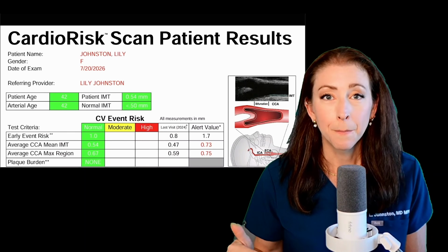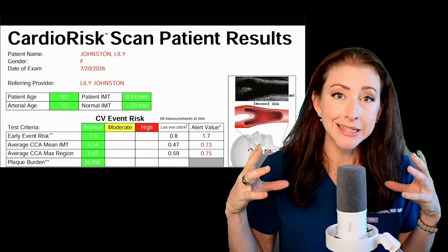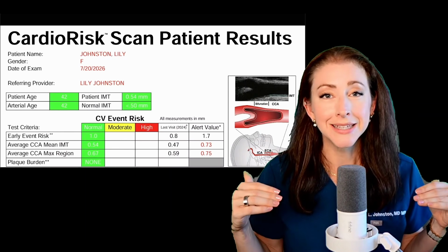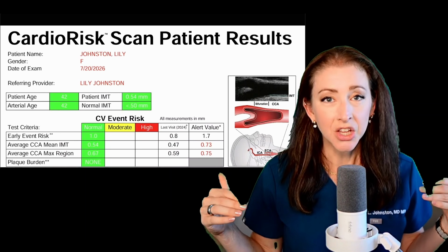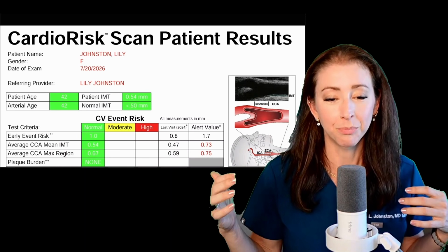There aren't big areas that are super thickened and then it gets thin again and then it gets thicker, right? Again, think of this like pavement or asphalt. You want a nice, smooth, even surface. You don't want potholes and bumps and tree roots and all kinds of stuff mucking the road up.